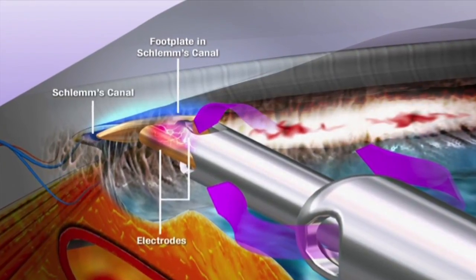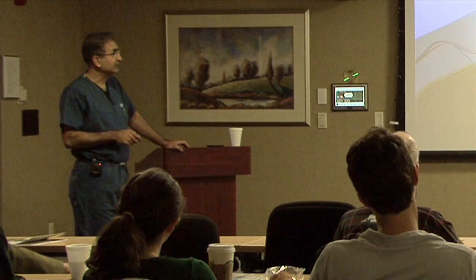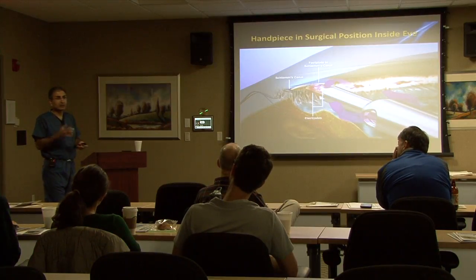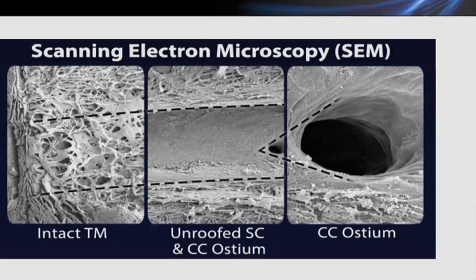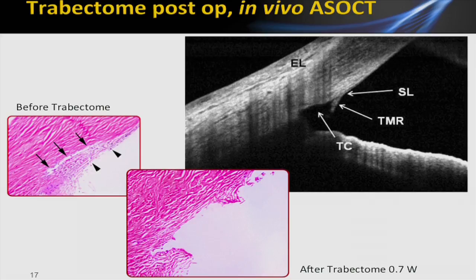Here you've got the probe inside Schlemm's canal. You can see a couple of little areas of collector channels where you're getting a tiny bit of reflux. With the improved irrigation system they now use, it's rare that you'll see blood reflux actively while you're doing it because the IOP is usually high enough to prevent that. In the beginning, if you're not sure you're in the right place, you can turn the infusion off, let the eye soften, and see if you get reflux — if you do, you know you're in the right place. Here you can see the intact TM, the unroofed inner wall of Schlemm's canal, and the collector channel ostium. Before the trabectome, you can see a normal appearing angle, and after trabectome on UBM and histopath, you can see how Schlemm's has been unroofed.